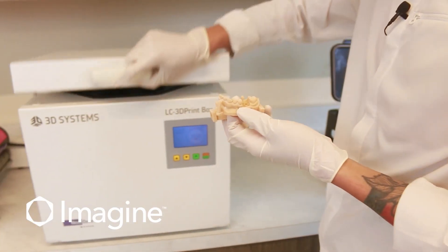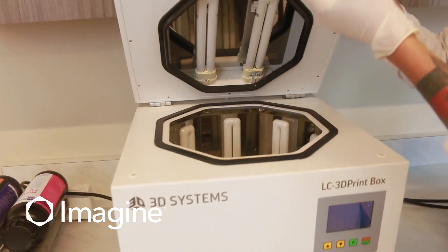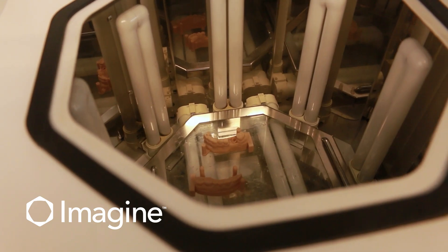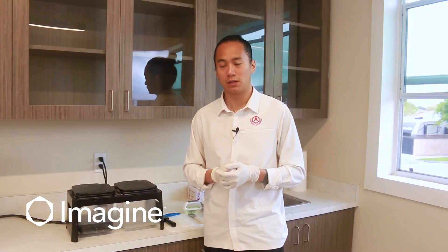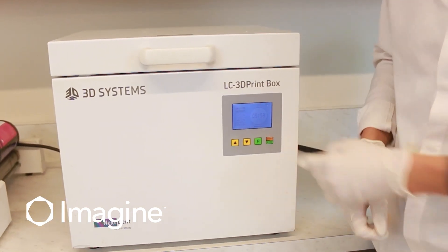Once your parts have dried, place your units inside the light cure — just place them one at a time, nice and flat, onto the platform. Make sure to double-check the material label on the bottles so that you're curing for the appropriate amount of time, and go ahead and press the start button.